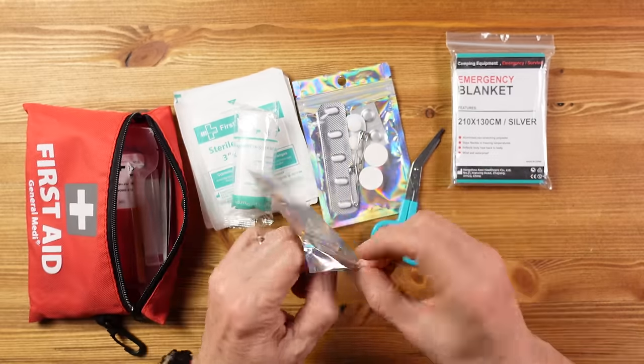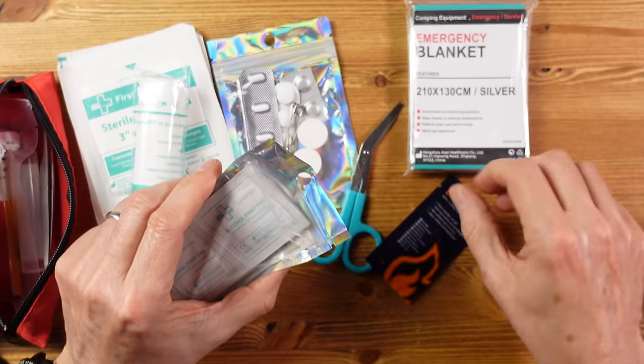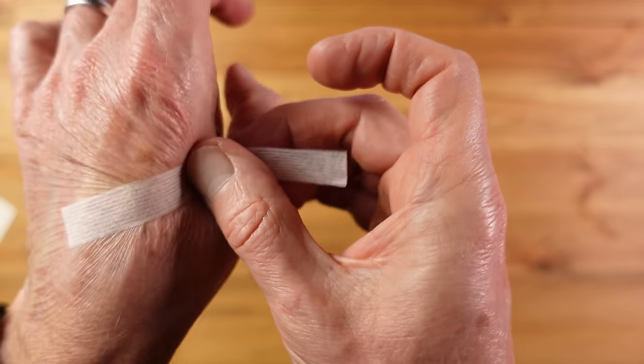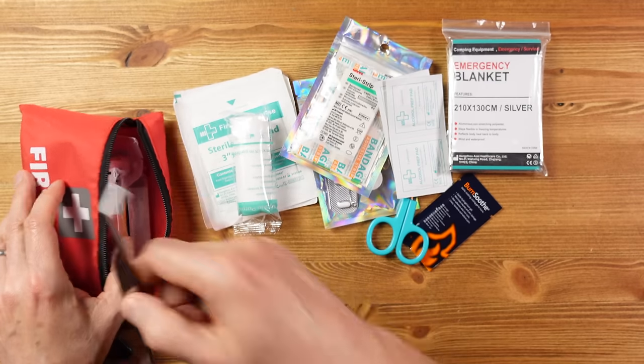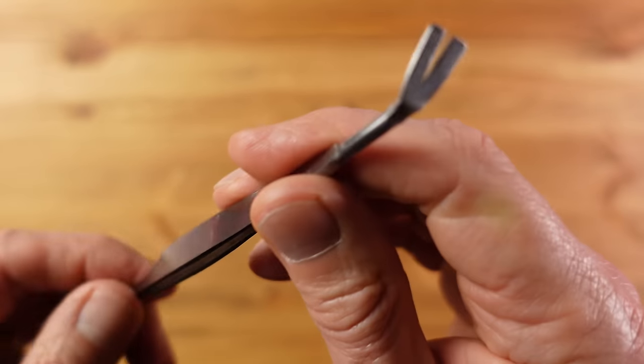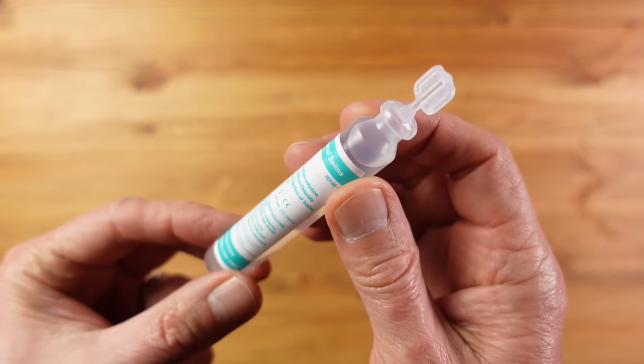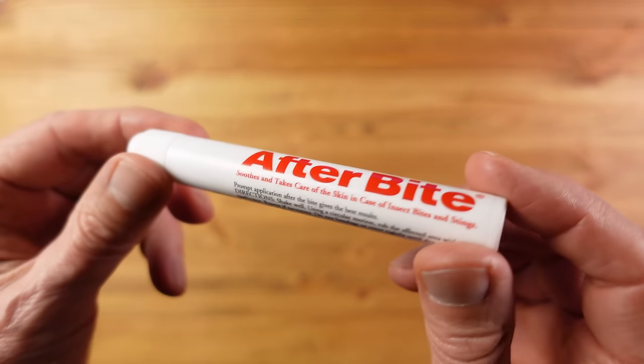I've also got some burn soothe gel, alcohol prep wipes, one set of steri-strips just in case you need to close a minor wound, and a whole range of band-aids. Then there are some tweezers — ideal for picking out splinters or bits of grit from a wound — and on the end a tick remover, which can be very useful if you're out in the wild. And there's some saline solution for cleaning out a wound or washing out an eye that's got some grit in it — not much, but enough for a small wound. I've also got an anti-bite remedy just in case somebody gets a sting or a bite when out and about.